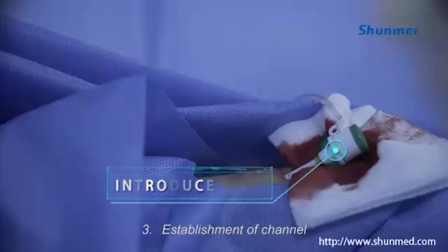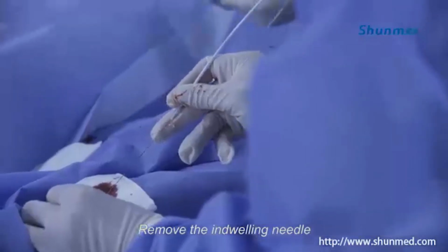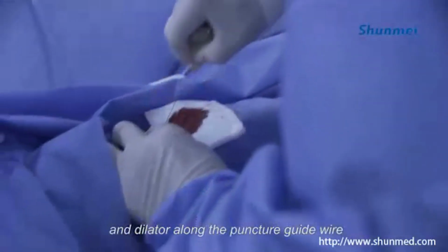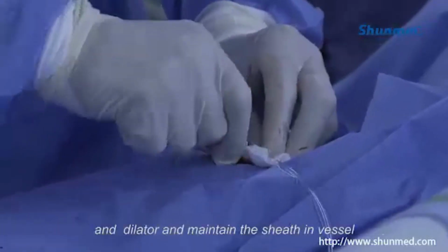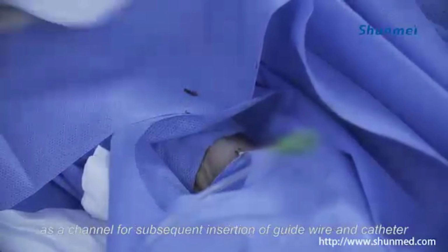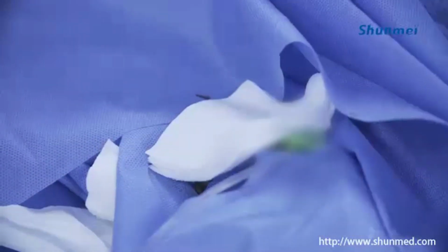3. Establishment of channel. Remove the indwelling needle. Insert the introducer sheath and dilator along the puncture guide wire. After that, withdraw the guide wire and dilator and maintain the sheath in the vessel as a channel for subsequent insertion of the guide wire and catheter.